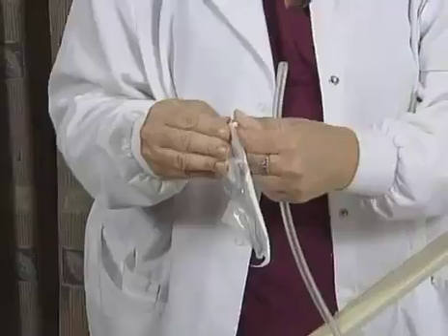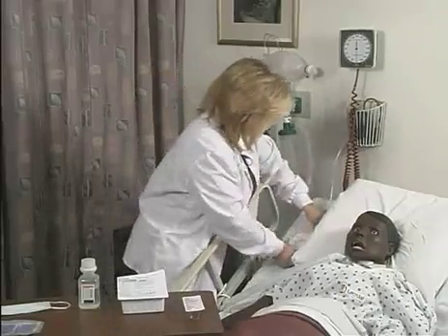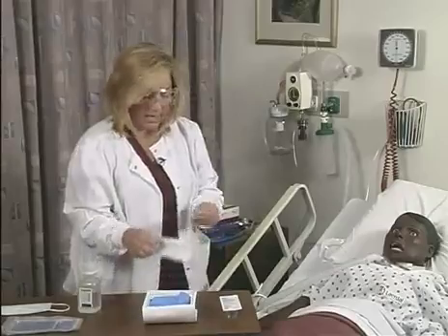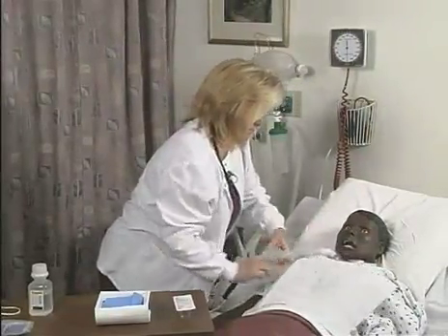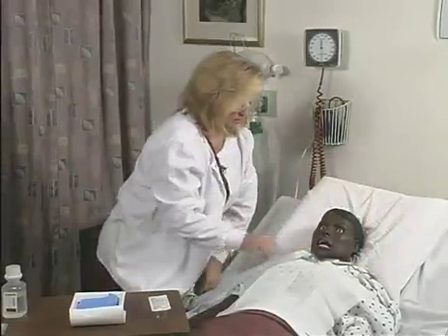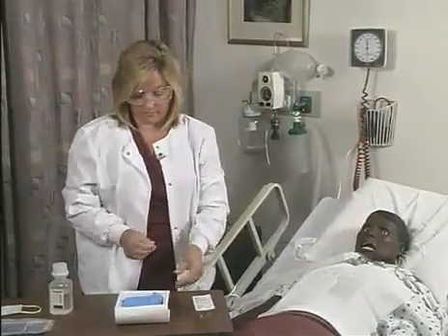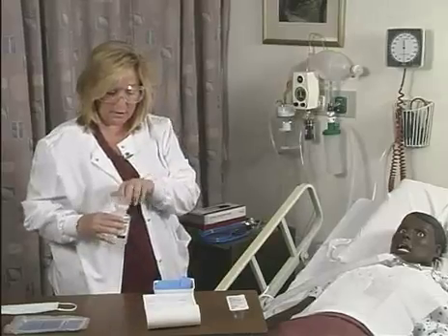The next step is I'm going to attach my sterile suction catheter to my suctioning equipment. I'm going to open up my tracheostomy care tray and I'm going to place this drape across the patient's chest. I'm going to disconnect the tracheostomy mask. Now I need to pour some sterile saline into my tracheostomy tray.